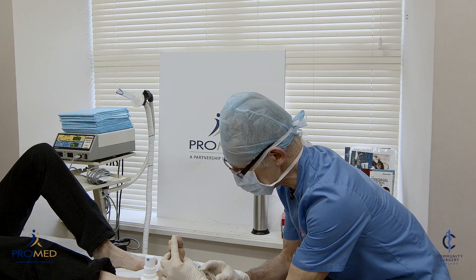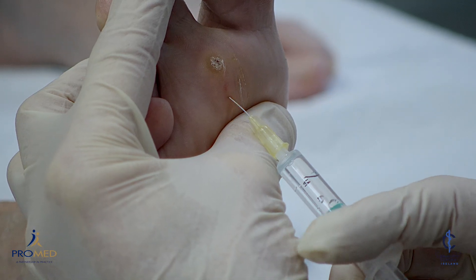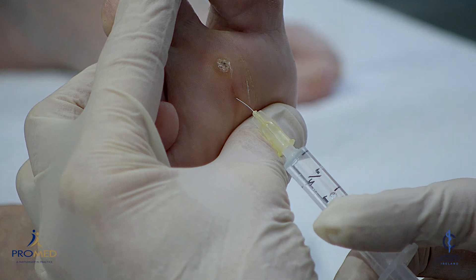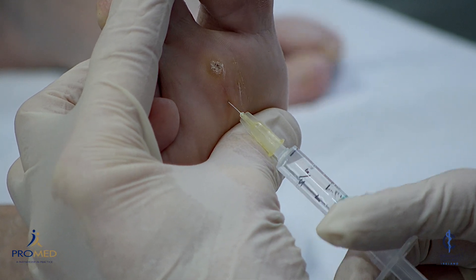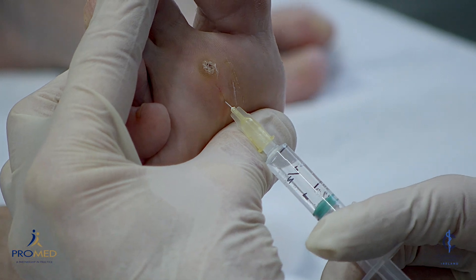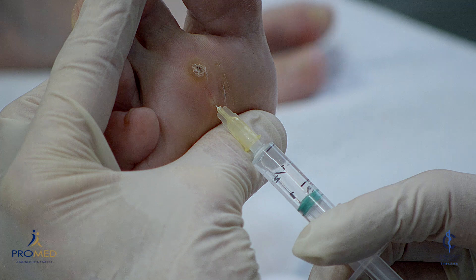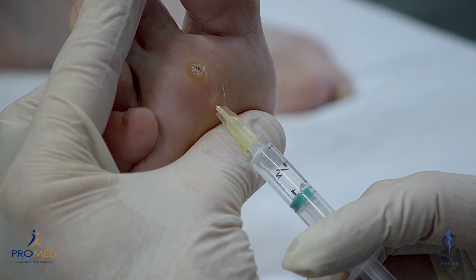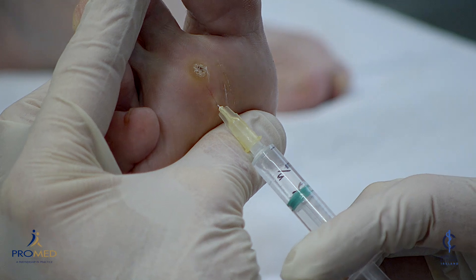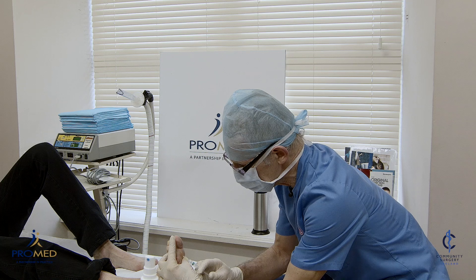It's just getting in through the skin that's the sore bit. Once we get underneath it's a bit easier. So we're in under the skin now. I'm just infiltrating under the plantar wart. You might see it starting to raise up a little bit and go a bit white. You all right, Pauline? So that's the hardest bit over.